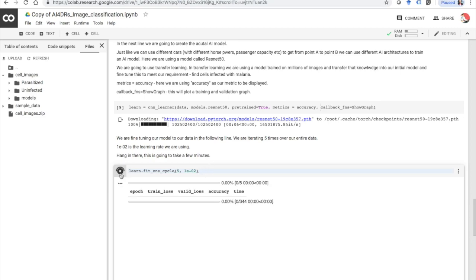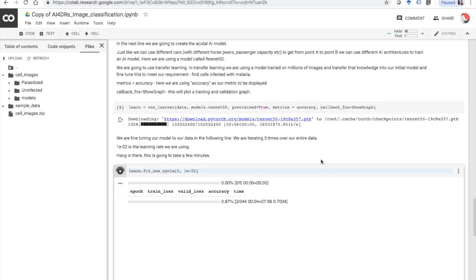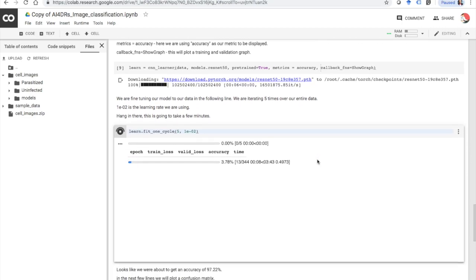This is going to take actually a few minutes, maybe 10 to 15 minutes. You will see five iterations or epochs printed out here. Once it's done you will also see a graph of training and validation loss. I'm going to break the video and come back when this is done.